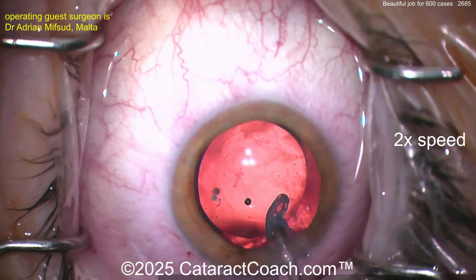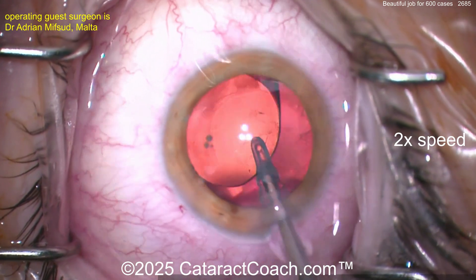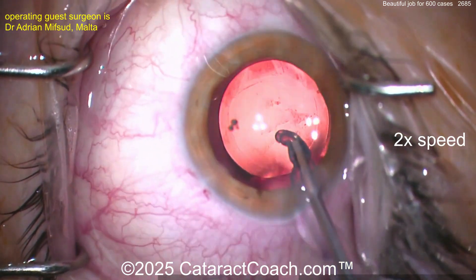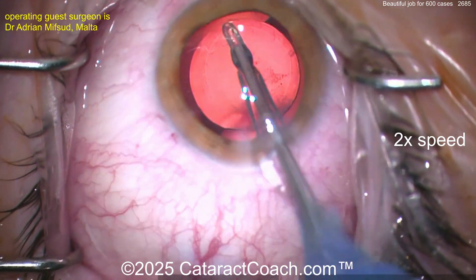I'd go behind the optic — at 600 cases you can definitely go behind the optic. So going behind it, good job. Now you can try getting more of that stuff off the posterior lens capsule if you want. The other option is you can just YAG it later. If it doesn't come off, it doesn't come off — what can you do? But I'd be a little bit more persistent on that stuff.